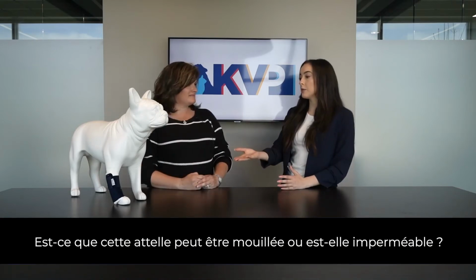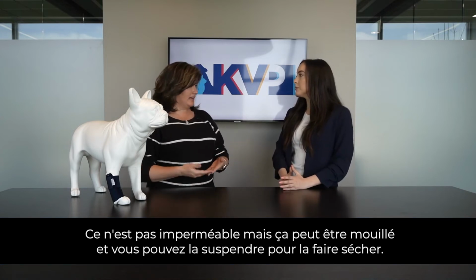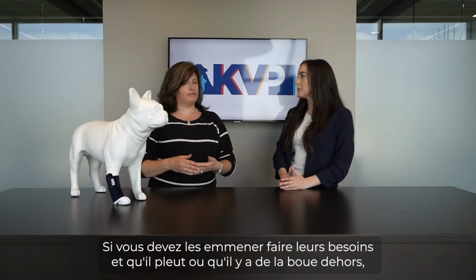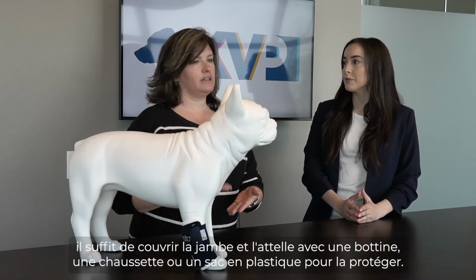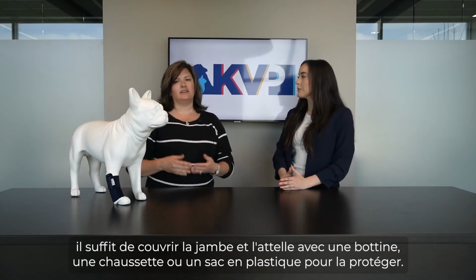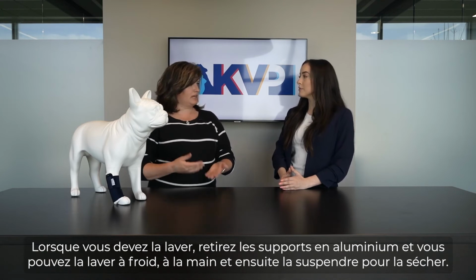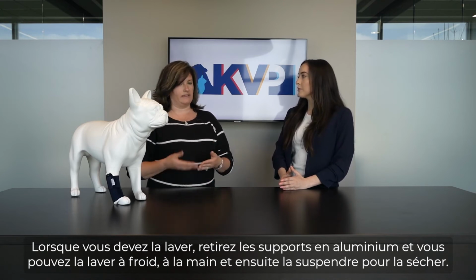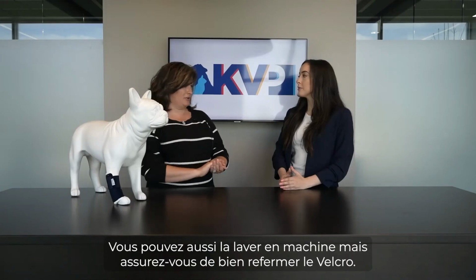So is this brace able to get wet or is it waterproof? It's not waterproof, but it can get wet and then you can hang to dry. If you need to take them out to the restroom and it's raining or muddy outside, just cover the leg and the brace with a bootie, a sock, or a plastic baggie to protect it. When you need to wash it, for this one, remove the aluminum splints and you can hand wash in cold and then hang to dry. You can also machine wash this one, but make sure you close the Velcro back down.